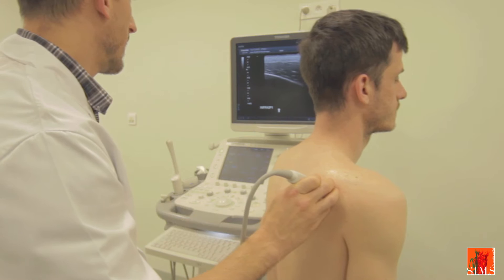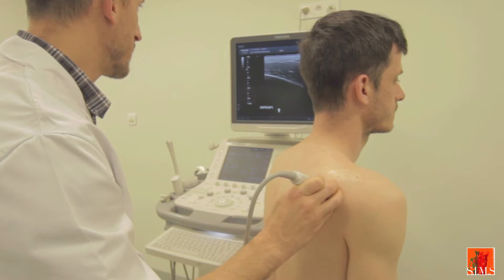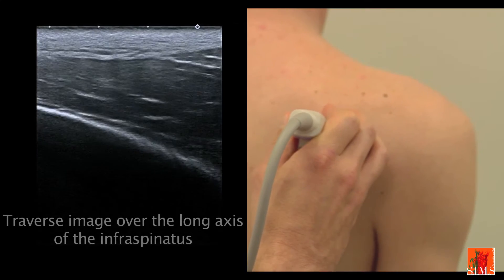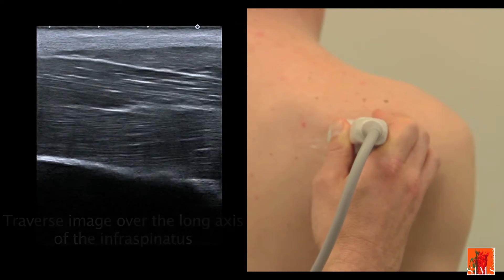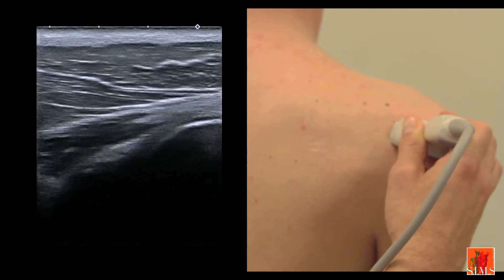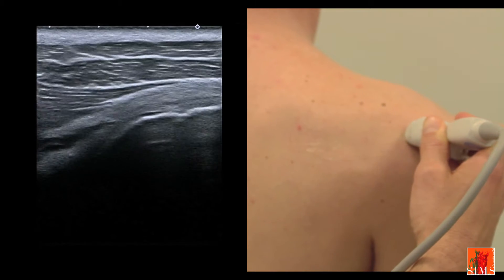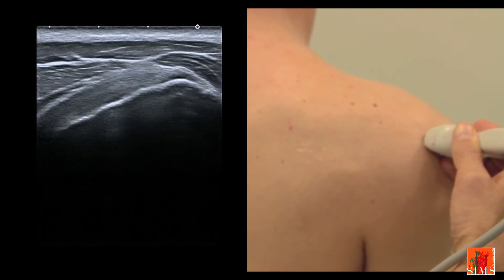The following image is a long axis view of the muscle and the infraspinatus tendon. We start from the sagittal image and swivel in an oblique horizontal plane which follows the obliquity of the infraspinatus muscle. Then we follow it, travelling toward the scapulohumeral joint which we view in depth, then towards its insertion on the greater tubercle of the humerus.